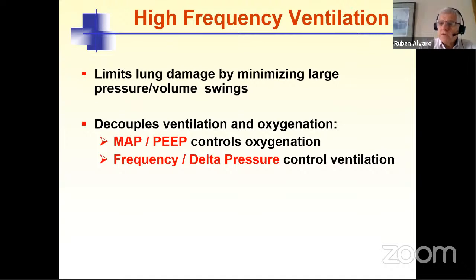Actually, it's relatively easy when you understand the principles of high frequency ventilation to ventilate babies on high frequency. There are very few knobs. There are very few parameters that you need to change and learn how to modify. So I would say that using conventional ventilation, especially if you don't have volume guarantee, is more difficult than ventilating babies with high frequency.